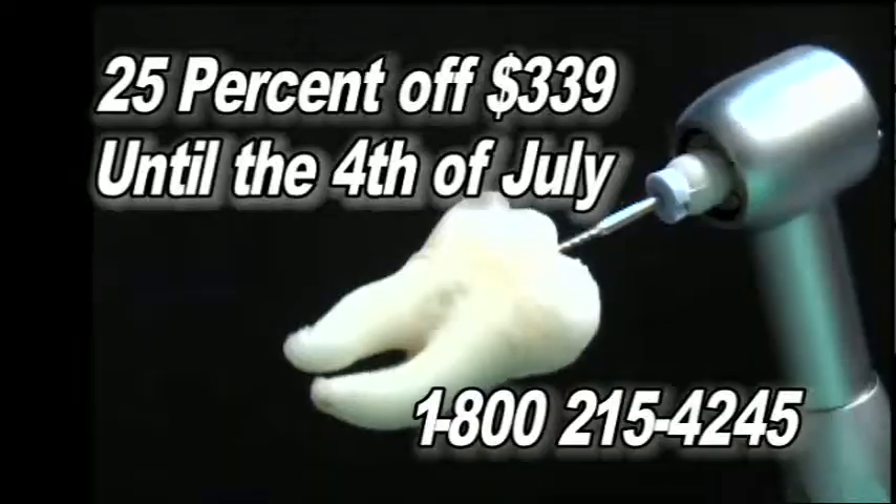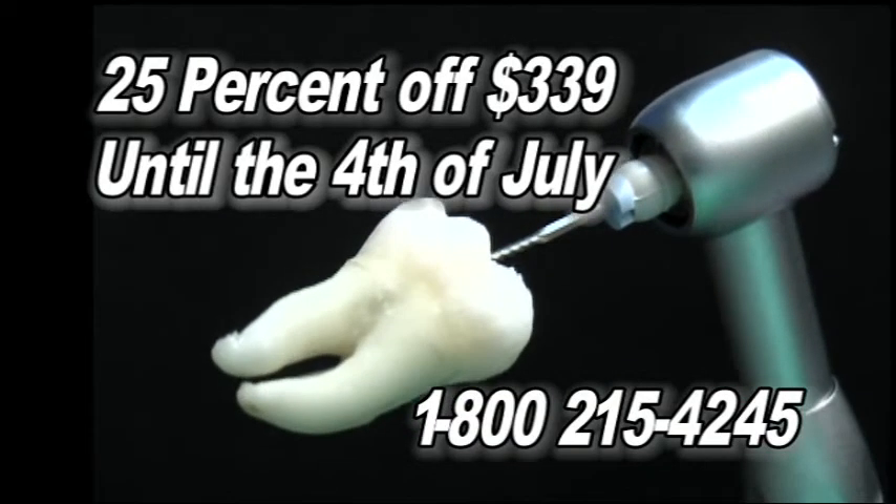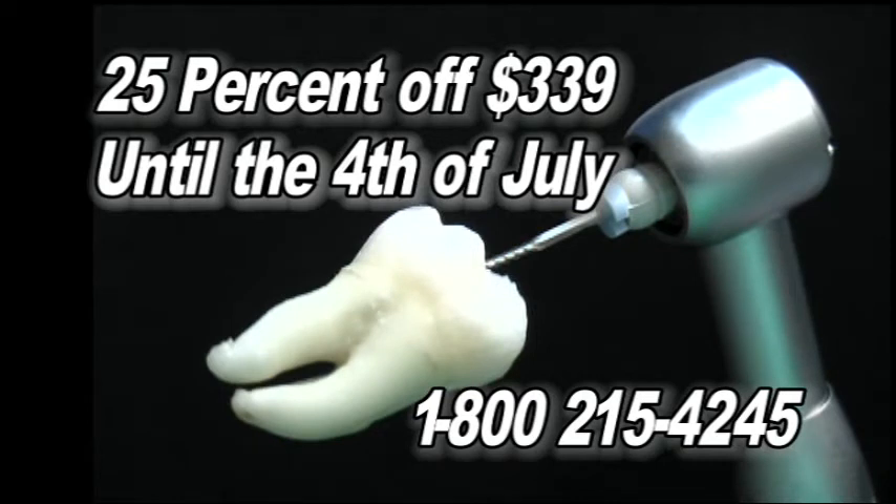Now this handy little gadget used to be rather expensive. You can buy a similar handpiece for about twice what the retail price on the EndoGripper is at this point. Here's the special deal: purchase the EndoGripper between now and the 4th of July 2011, and you'll be able to get a 25% discount off the regular price of $339. Just call 1-800-215-4245 and mention Gripper 25.